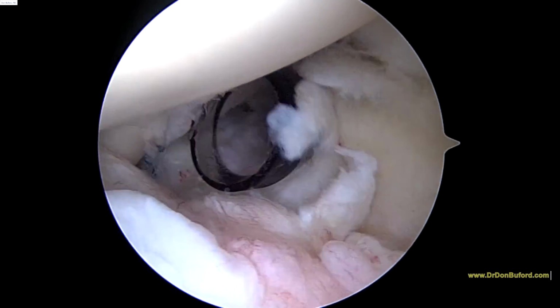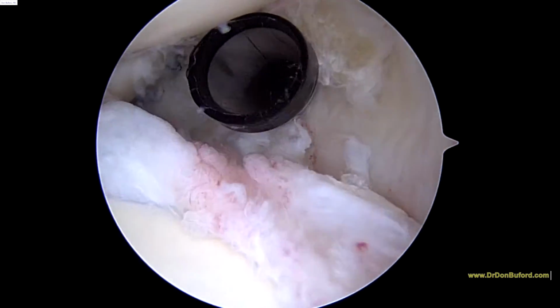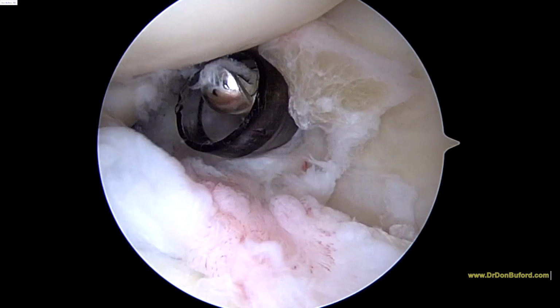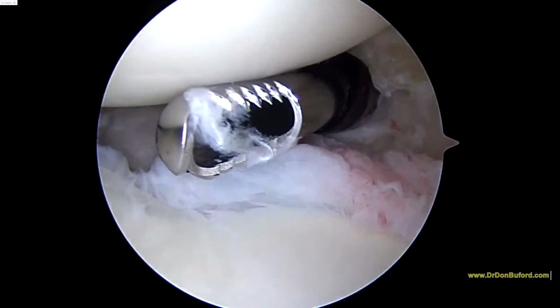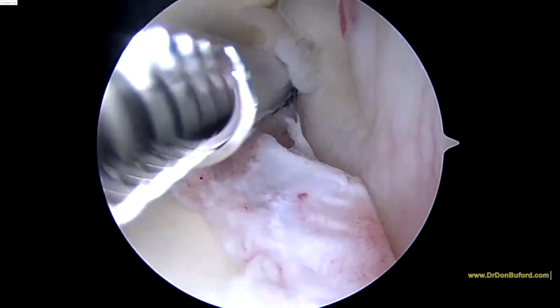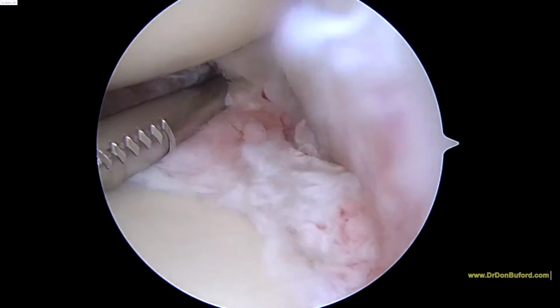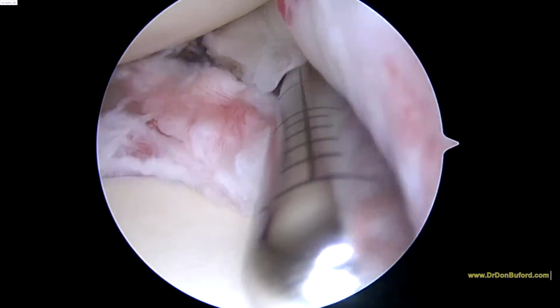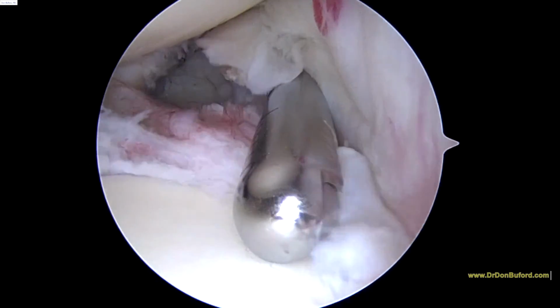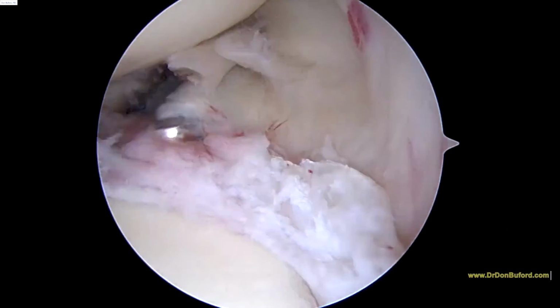Okay, so we've cut the biceps tendon here. There's the cut edge. And now the reason this will work is because now it won't tug on the labrum anymore here, and the labrum will get a chance to recover and heal. We're going to put in a shaver just to make sure there's no more rough edges in here. Nothing that can catch or cause any symptoms. So where we are right here, this is the superior labrum. And you can see the biceps used to be basically right there.